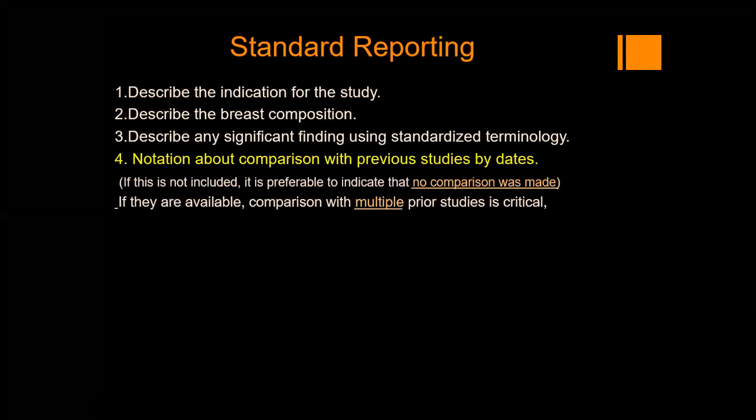And you know the importance, if there are multiple prior studies, of comparing with all of them is crucial, as you have seen in many examples how it can help sometimes in between. Maybe the lesion was previously available but missed due to a technical issue in the following mammogram.